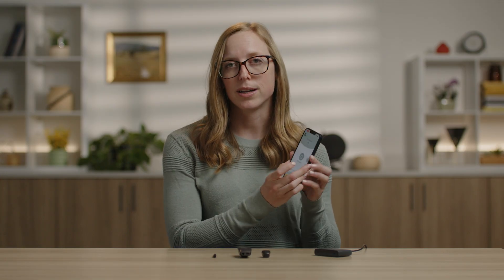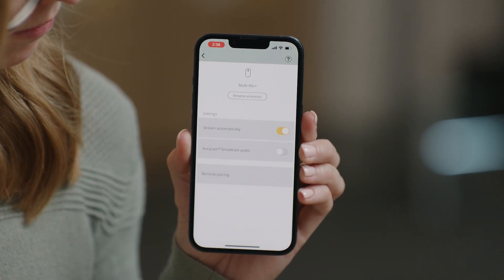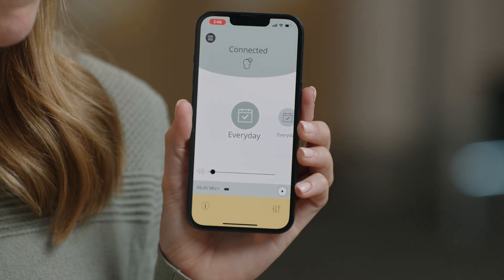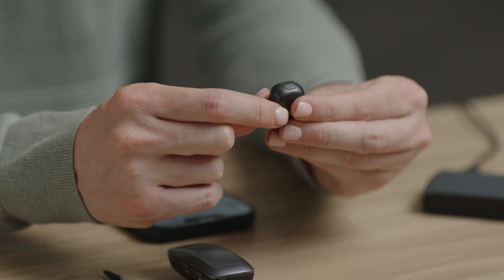Should you want to turn off auto streaming, this function can be toggled off within the Baha Smart App. If you have auto streaming turned off, you will need to initiate streaming by pressing play next to the MultiMic Plus icon in the Baha Smart App. To stop streaming, press stop. Similarly, to start streaming without the Baha Smart App, press and hold the program button on the top of your Baha 7 sound processor until you hear the upward melody. To stop streaming, press and release the program button on your Baha 7 sound processor to return to the program you were in before streaming.